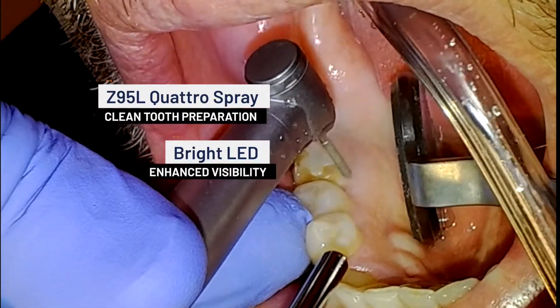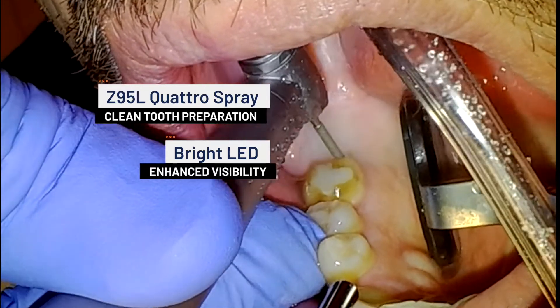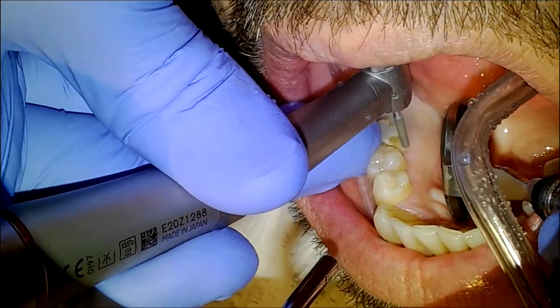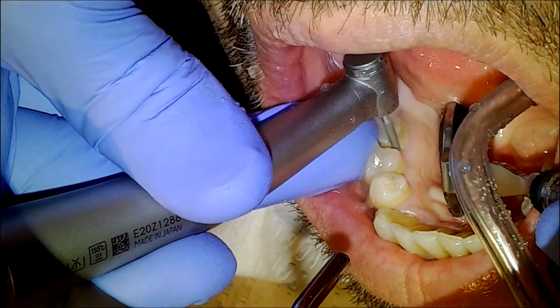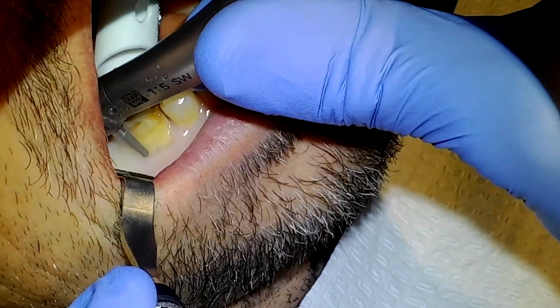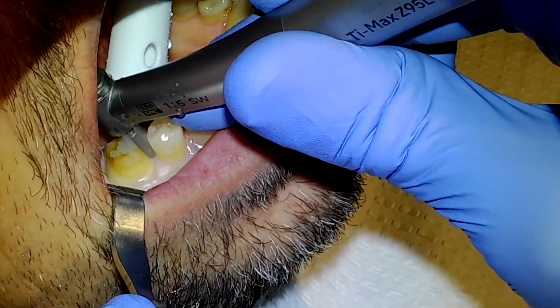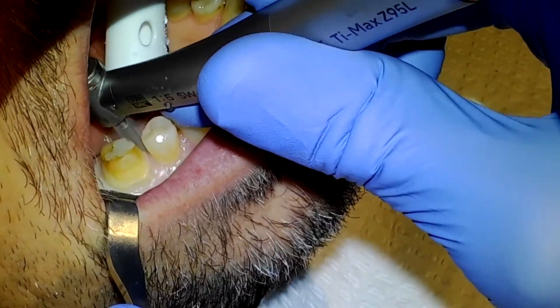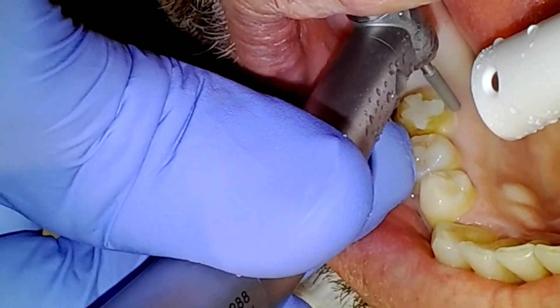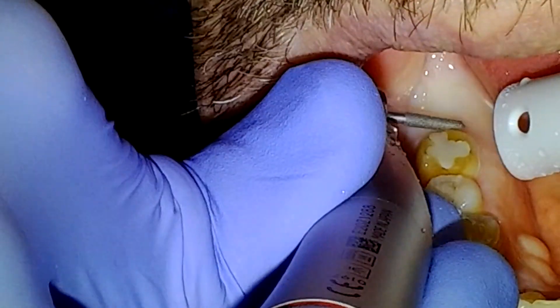The Z95L's four-nozzle quattro spray and bright LED are especially critical for enhanced visualization in the difficult-to-see areas of the distal and lingual surfaces of the tooth being prepared. Even as I prep along the delicate gingival border and the interdental papilla, there is no bleeding or damage to the tissue. The constant torque, consistent burr speed, and low vibration of the handpiece are crucial not only for producing buttery smooth tooth surfaces, but also for protecting the soft tissue.